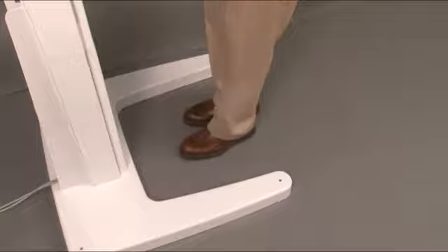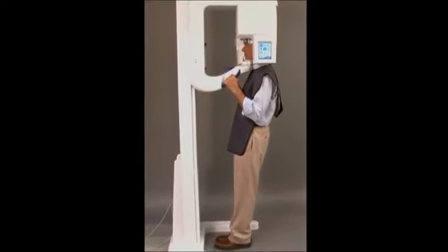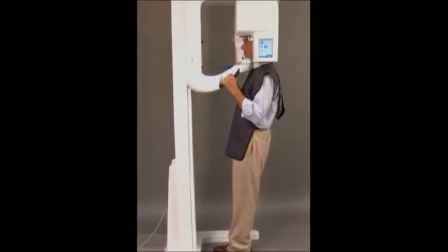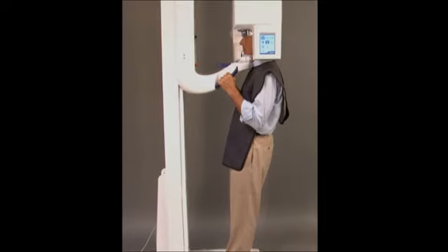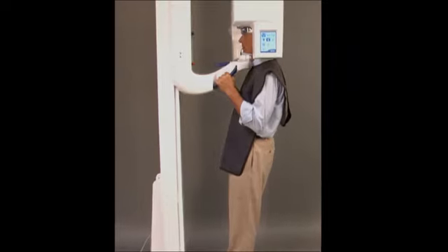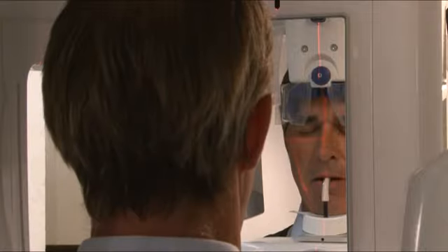Ask the patient to step forward slightly. This positions them out of balance and hanging onto the support handles, and forces them to stretch their neck as far as possible. This decreases spinal shadow on the anterior region of the pan. Check that the patient has not moved and is still in the correct position.